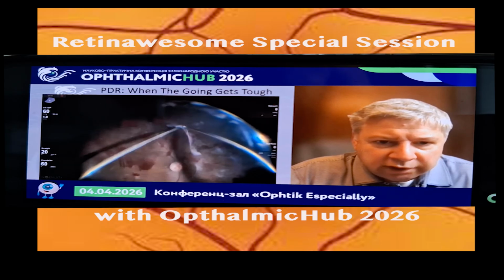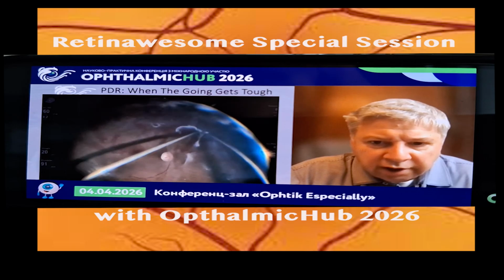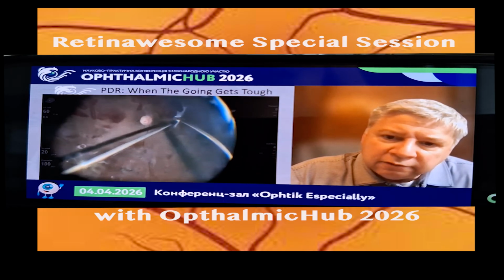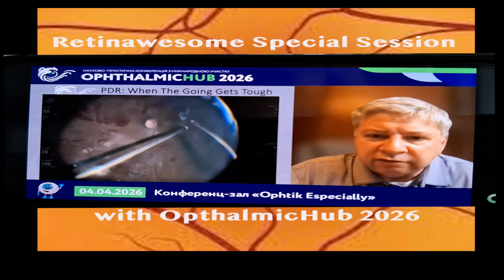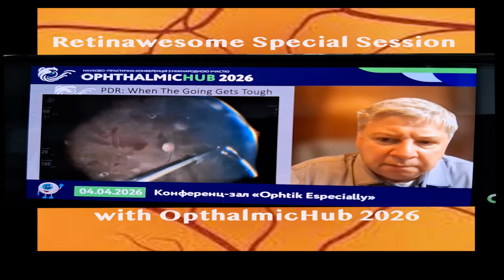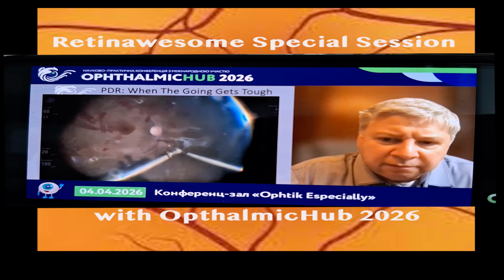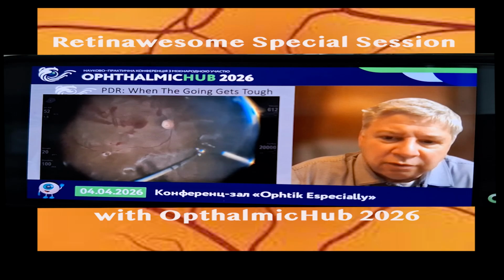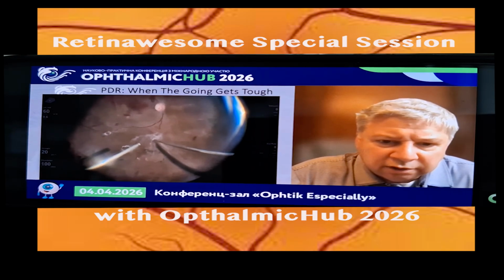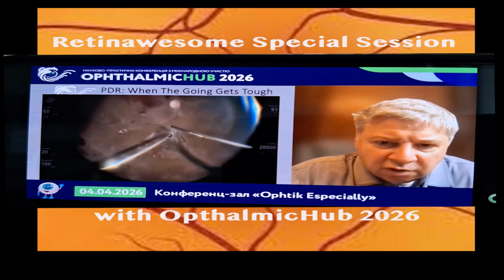Wherever we're pulling, everything is stuck, and we're trying to release the traction very gently by manual dissection, but we're still running into atrophic underlying retina. I did the back cutting technique. We're pulsing with short cuts on the cutter. You'll see here just how tenacious these membranes are.